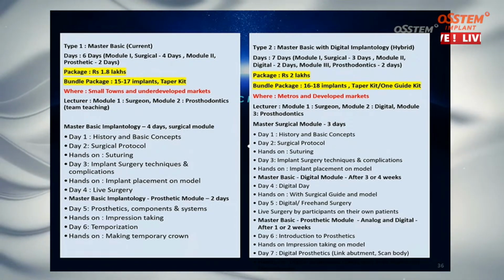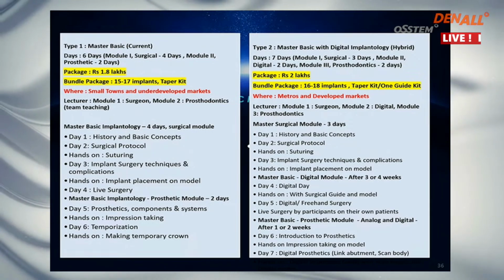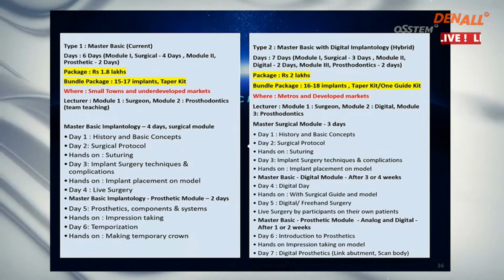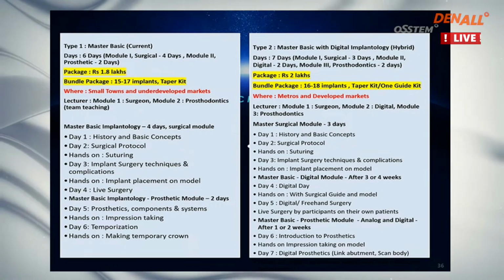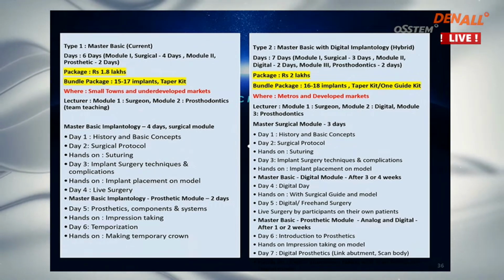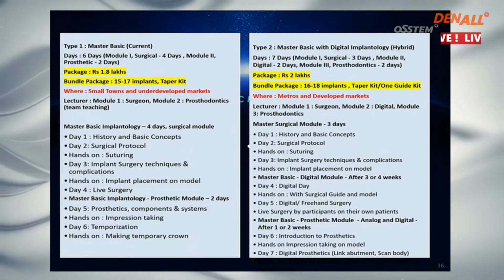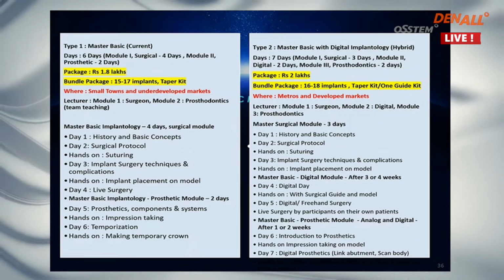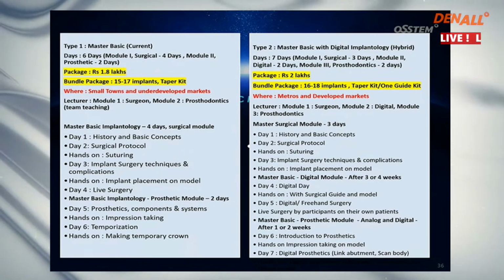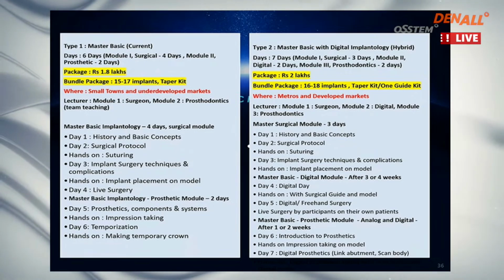If you just want to place an implant, you'll be placing implants in all sorts of positions, all sorts of angulations. And then when it comes to the prosthetic part of it, you'll be landing in trouble. And you're putting the trouble on the prosthodontist. You say to him, hey doc, the implant is integrated very well. I can't remove it. Try to restore it.